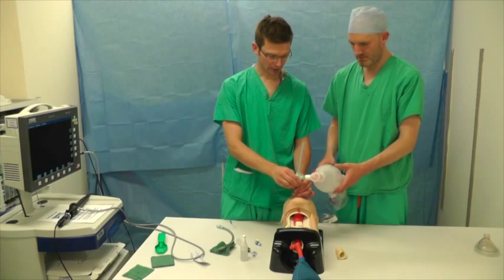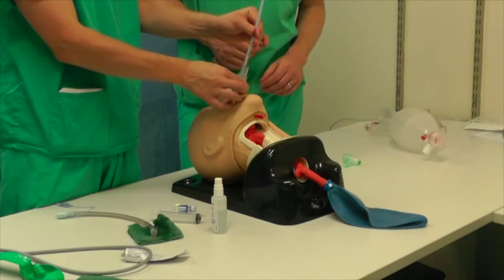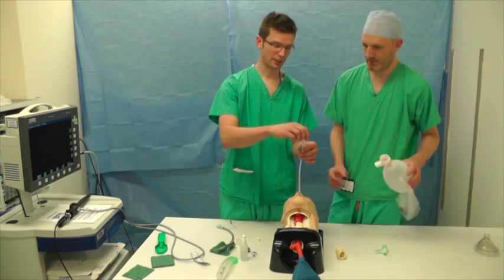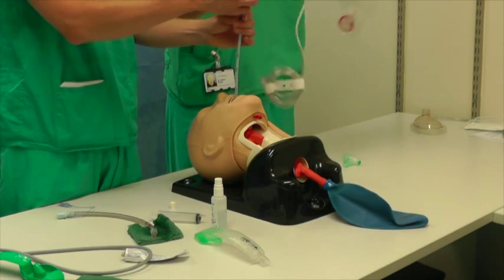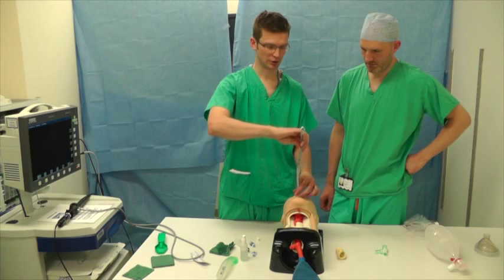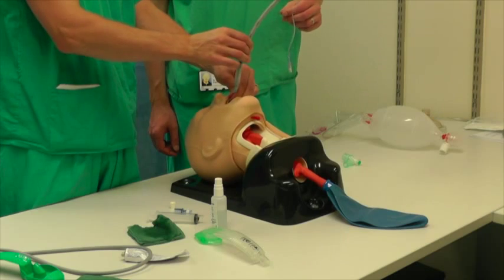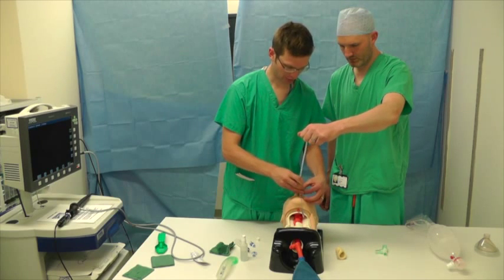Now we're going to remove the angle piece first. Hang on to the Aintree, then remove the iGel. At this stage, if you did need to maintain oxygenation, you can attach your RappiFit connector to the top of the Aintree and bag the patient. Then take your tube and, using the Aintree just like a bougie, bring the Aintree out so your assistant can grab the outside end. Then as you pass the tube, use gentle rotation to help it slip through and around the vocal cords.